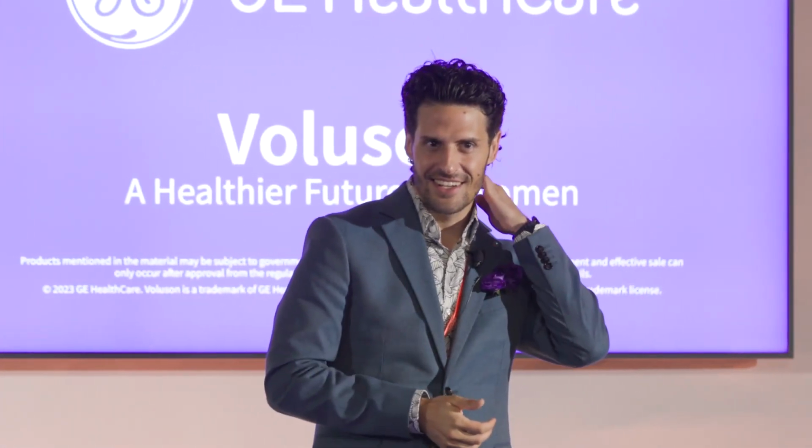Good morning, Professor. I'm Dr. Ku from the Philippines. I'm just curious, how much fluid do we need to instill to create those great images? Thank you for the question. I'm not officially professor yet, even though the program said that one day. The amount of fluid is variable. So I think the goal should be to put what you need.